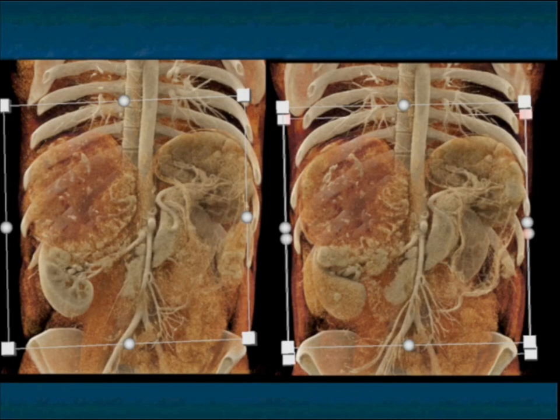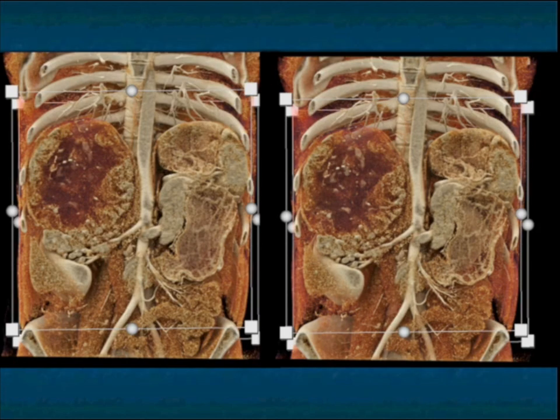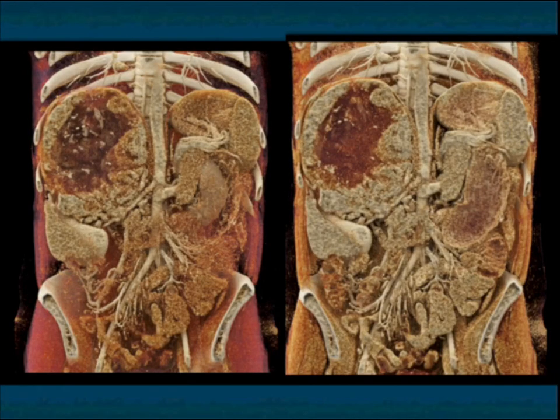We've looked at this also with cinematic rendering. Very nice example of tumor necrosis, solitary areas of calcification. You can see the various enhancement. The red tends to be necrosis. The more white, more vascular areas. Very nicely seen as we look at the various rendering parameters of primary adrenocortical carcinoma.